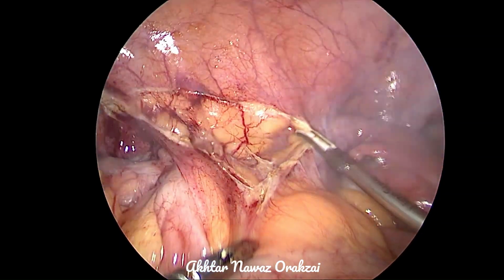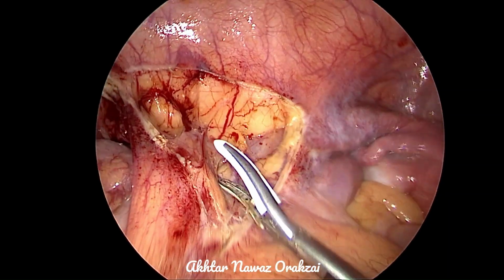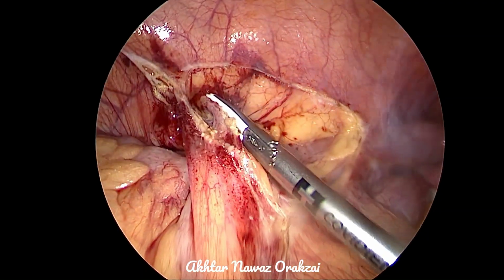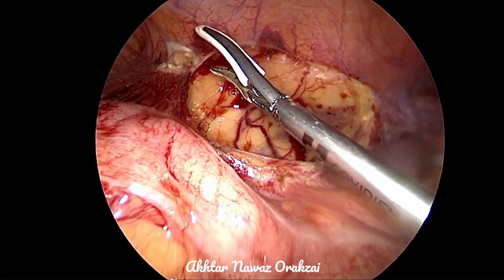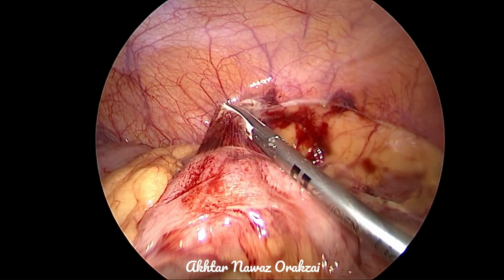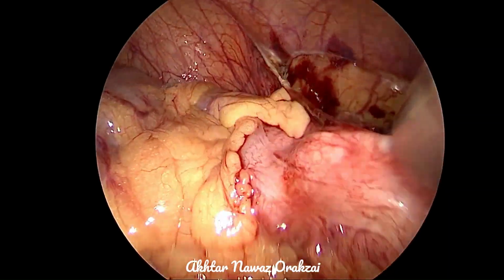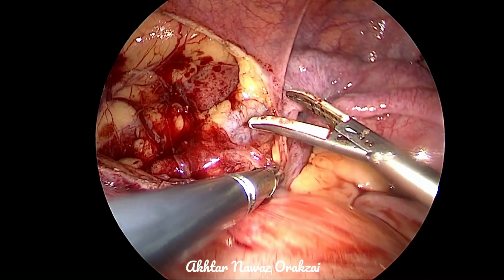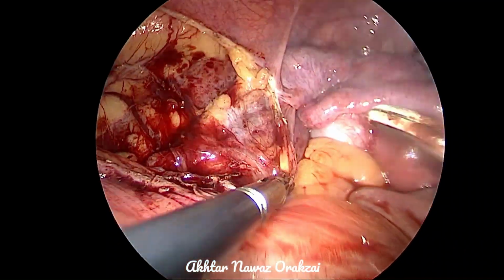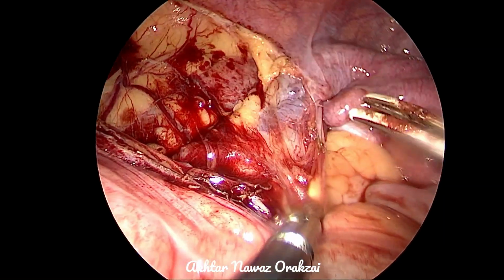For that we have to mobilize the sigmoid colon and identify the common iliac vessels, the common iliac bifurcation, and then identify the ureter, which is not very difficult to identify because it is already dilated so much that it comes to our way by itself.